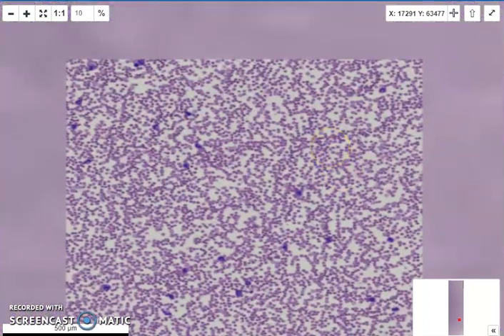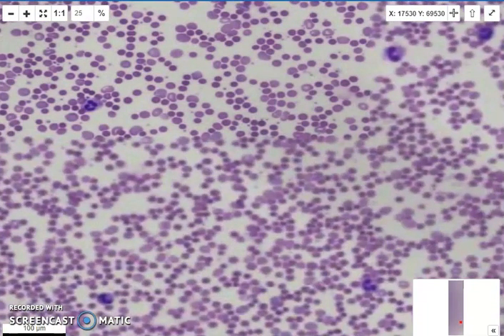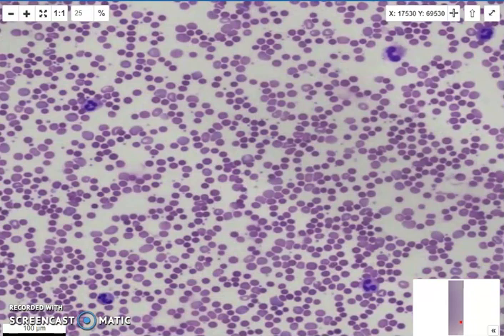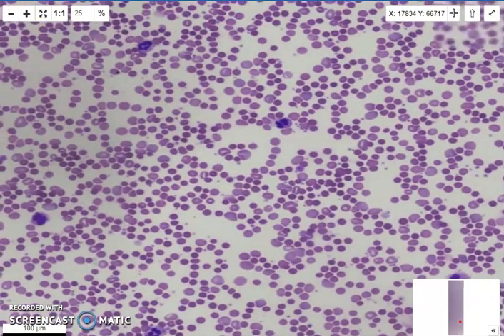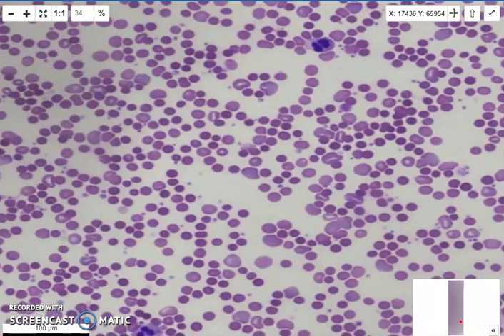And let's think, what's the first thing we notice about 5-4A when it loads? It's just the complete increase in the degree of hemolysis. So in this slide, let me click those polychromatic cells. I'm clicking them everywhere. Those big blue reticulocytes are everywhere.